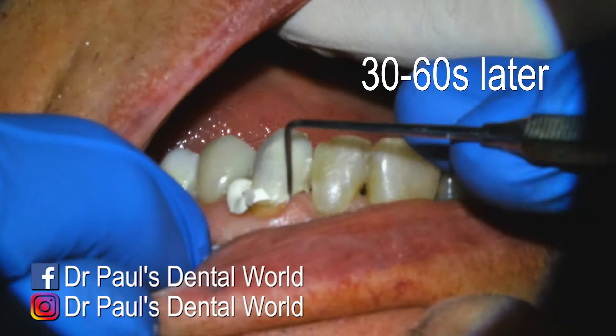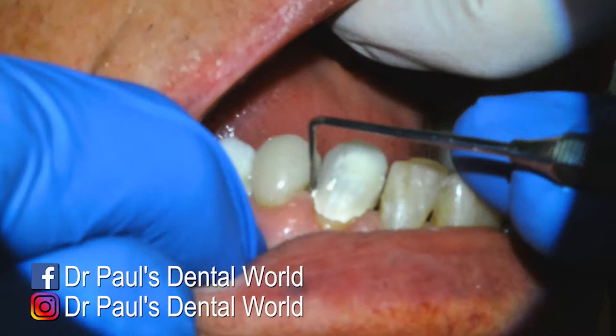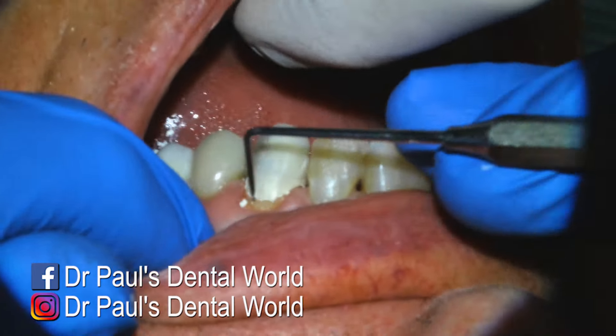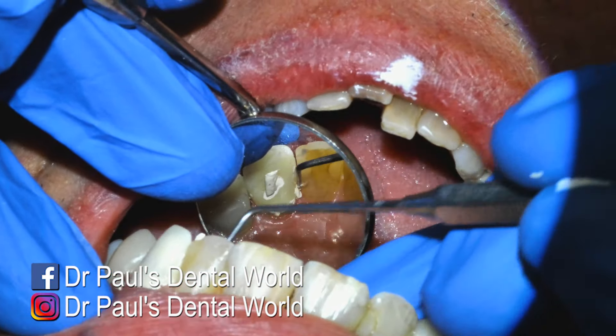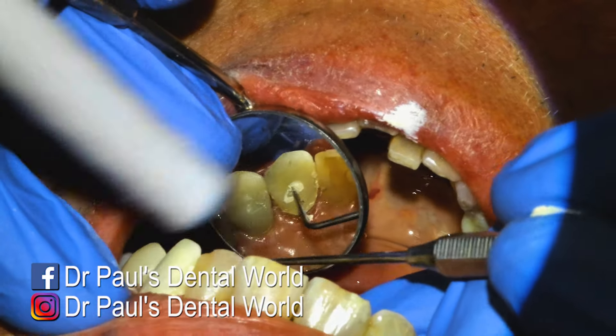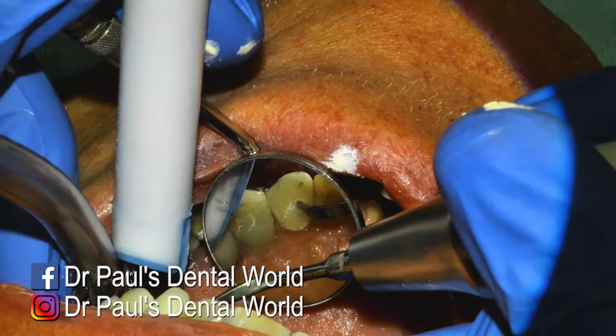So removing the excess is normally done with something sharp, like an explorer or a scaler. And we'll normally have the high speed suction close by just to pick up any flecks so they don't go down the patient's throat. Now you can also use your floss at this stage if you need to remove any interproximally. So just on the palatal, we'll now come to the big chunk of excess where that vent hole was. And we'll remove that first with the explorer and then we'll come to it with the ultrasonic.